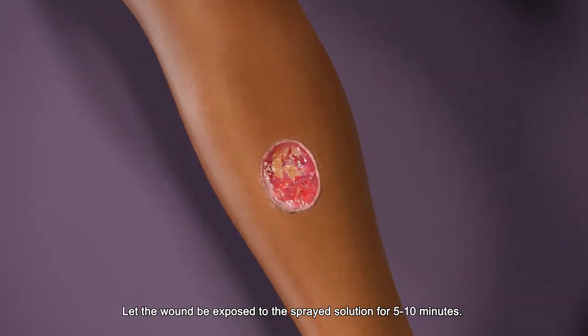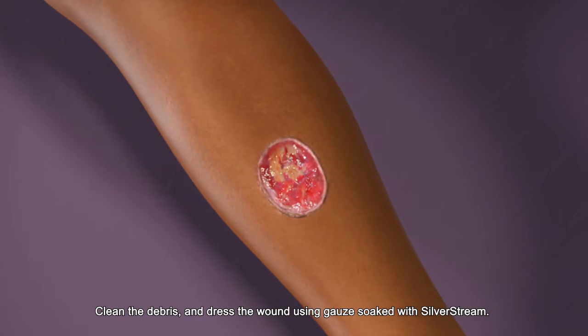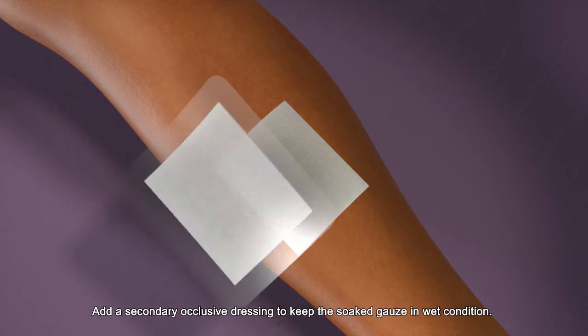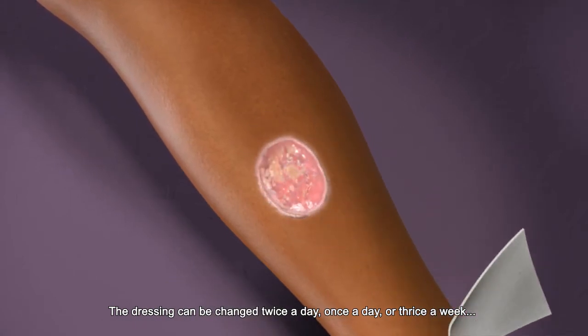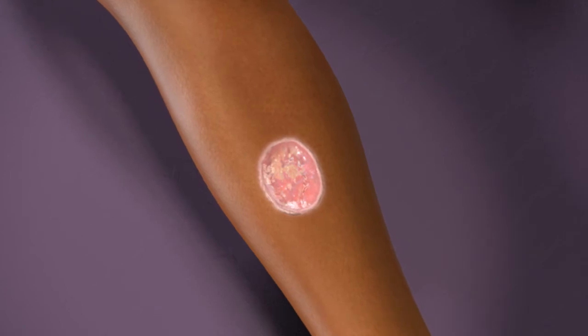Let the wound be exposed to the sprayed solution for 5-10 minutes. Clean the debris and dress the wound using gauze soaked with Silverstream. Add a secondary occlusive dressing to keep the soaked gauze in wet condition. The dressing can be changed twice a day, once a day or thrice a week depending on the type of chronic wound and infection. Thank you.